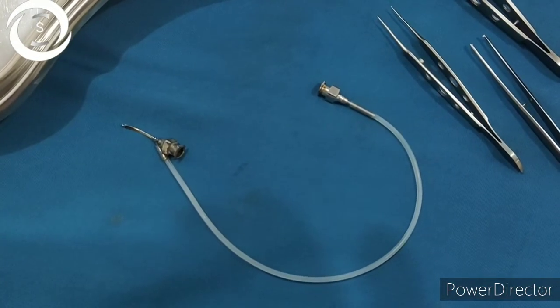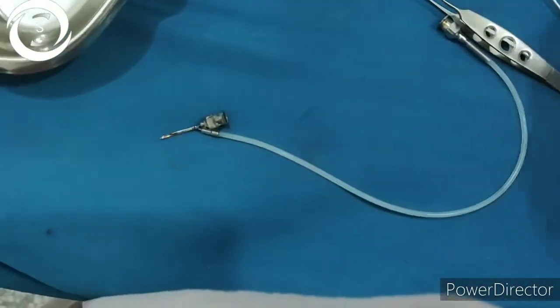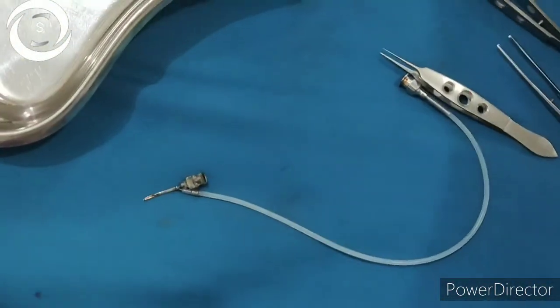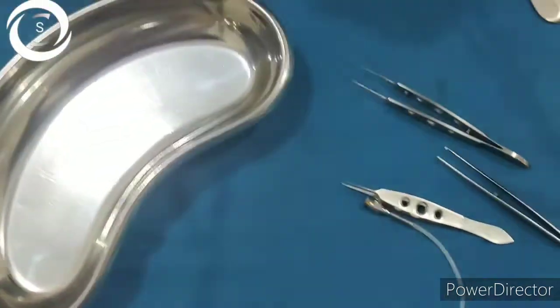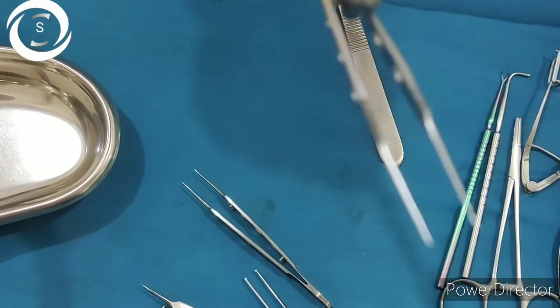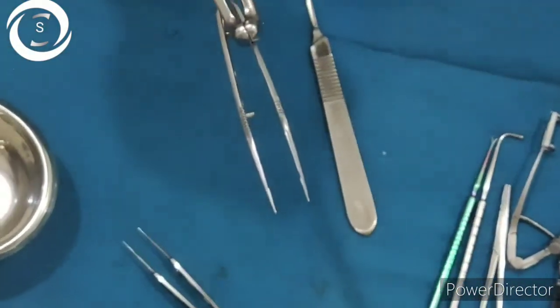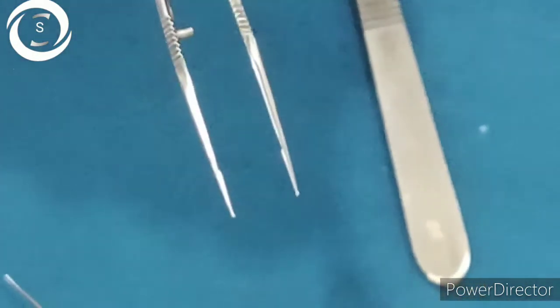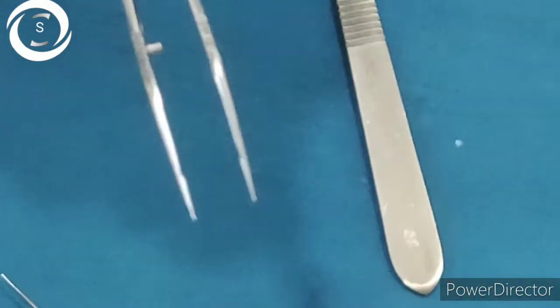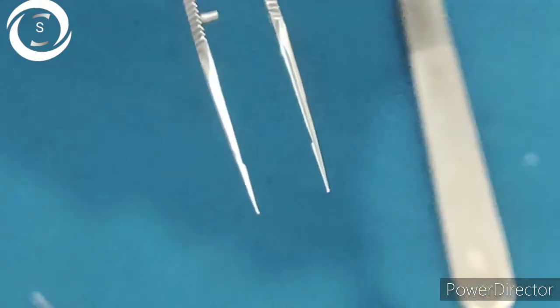This tube-like structure is the irrigation-aspiration cannula. It has an irrigation line and a syringe for aspiration. It is used to irrigate the anterior chamber and to aspirate cortical matter from the eye. That covers all the instruments used in cataract surgery — their names, how they look, and their functions.